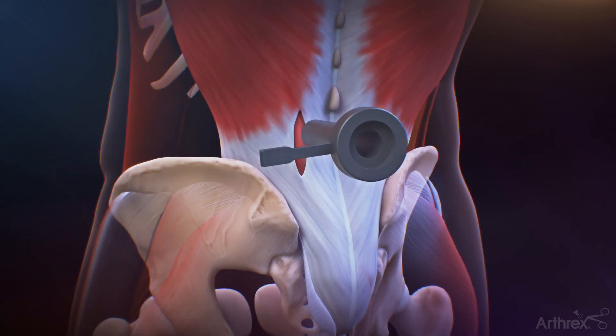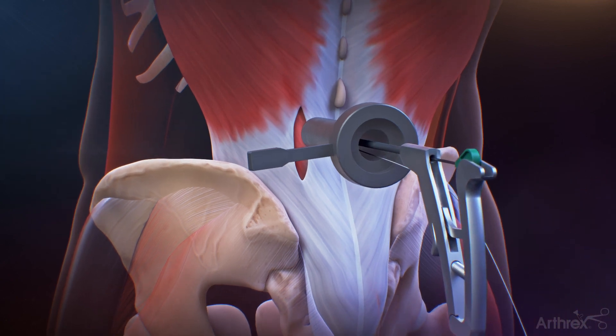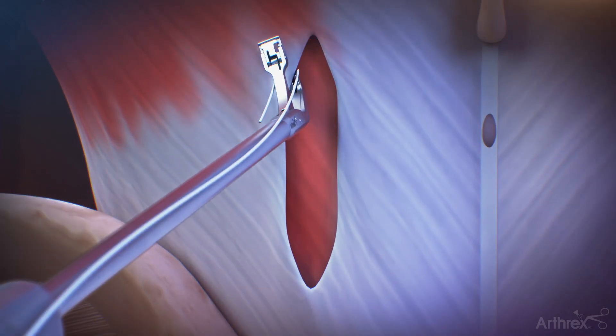With the suture properly loaded, pull the trigger to close the jaw and introduce the Scorpion into the incision to the depth of the fascia. Once the proper depth has been achieved, open the jaw of the Scorpion and slide the foot under the fascia.